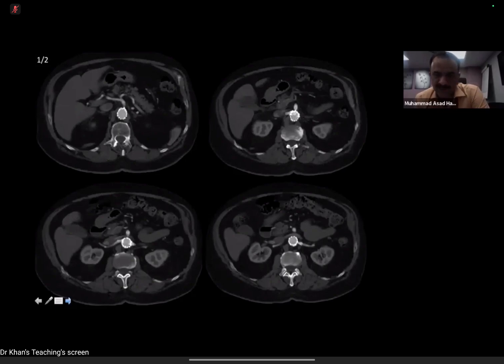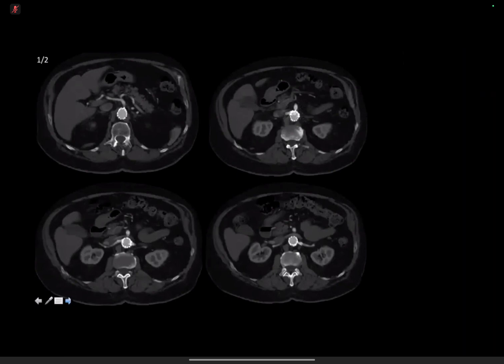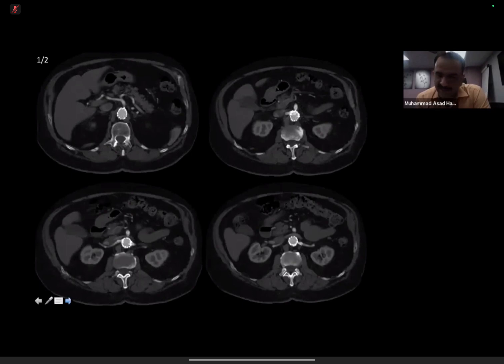So in order for these patients to have an effective procedure, they need to have the covered stent extended above the level of the vessels. Okay, if you extend the covered stent, it will cover the opening of all the visceral vessels. So in order to counter that, custom-made grafts are deployed, which have fenestrations for the vessels of both kidneys, the superior mesenteric artery, and the celiac artery.